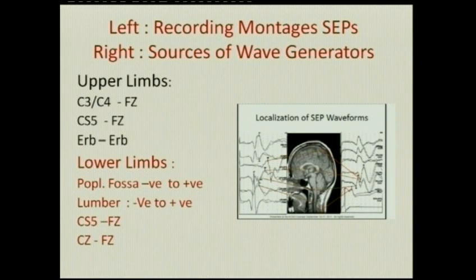For the recording we use some montages. It's not so important for you, but we look for the peripheral response. This side is the SEP for the upper limbs. This is from the Erb's point, and then you can see the cortical response, which is the N20. The other side is the P40. These cortical responses are very important, and one should also do subcortical recording, because these potentials are less affected by the anesthetic agents.